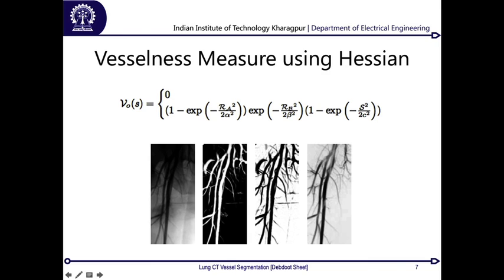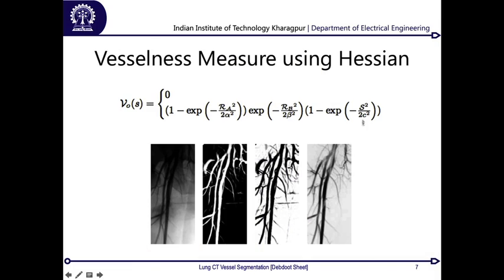You can always create this wonderful vessel segmentation, and you don't need any learning samples, you don't have bias variations across different imaging instruments, except for this tunability of alphas and betas and C's which you will have to do appropriately. Now this has been a state of the art for long. Since 1998 till 2012, when this challenge got announced, this was the state of the art.